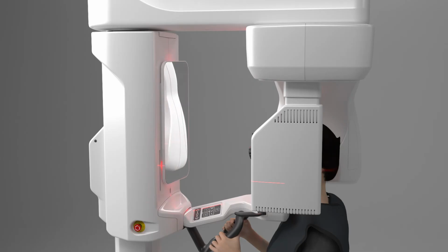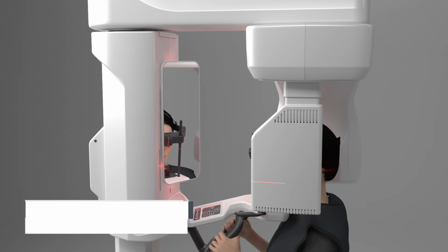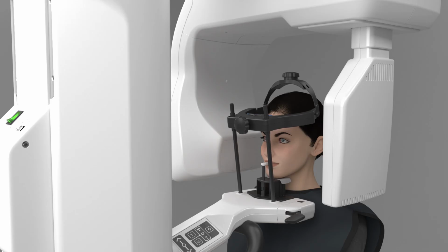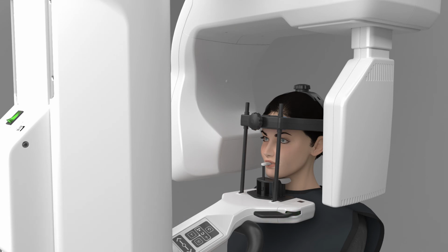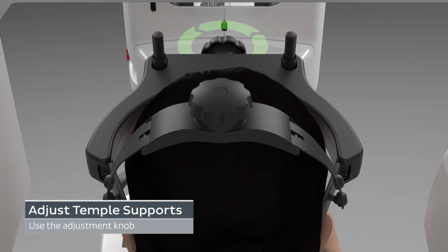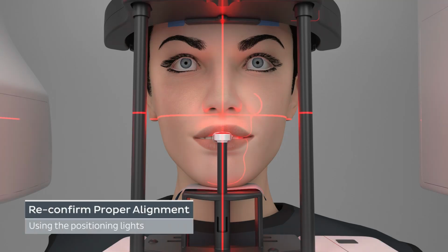You can open the mirror and use it to assist in positioning the patient. Close the mirror before you start the imaging. Move the head support against the patient's forehead. Adjust the height of the head support if needed. When complete, lock the head support using the locking lever. Adjust the temple supports using the adjustment knob. Reconfirm proper patient alignment using the positioning lights.